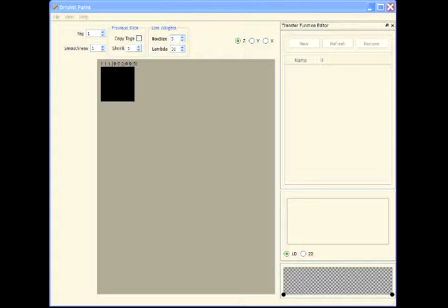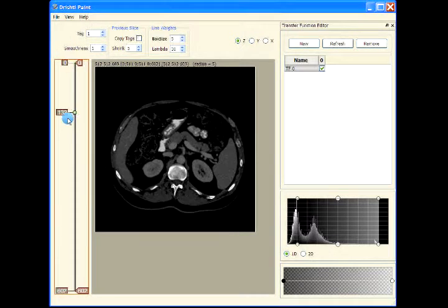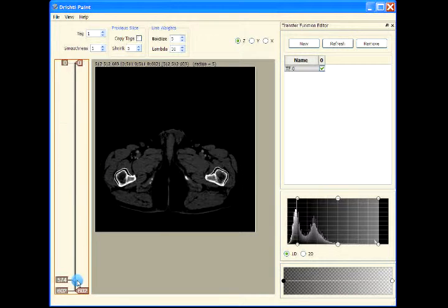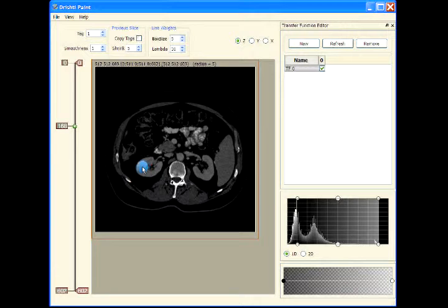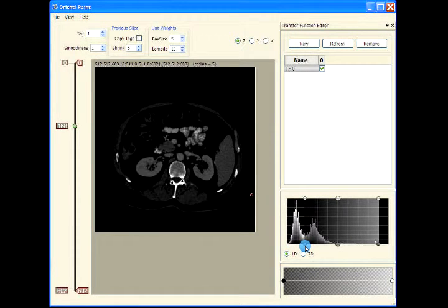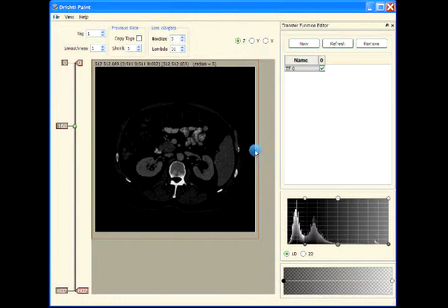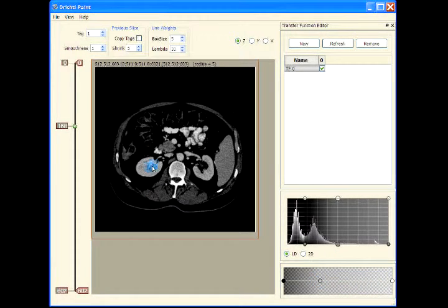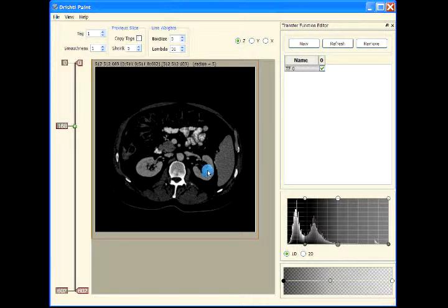In this video we will try to segment the kidneys and possibly the liver from the human torso dataset. This is the human torso dataset and we would like to segment the kidneys. This is the transfer function for that. What we will do is eliminate the air region and just tweak the transformation so that we get the kidneys showing nicely.